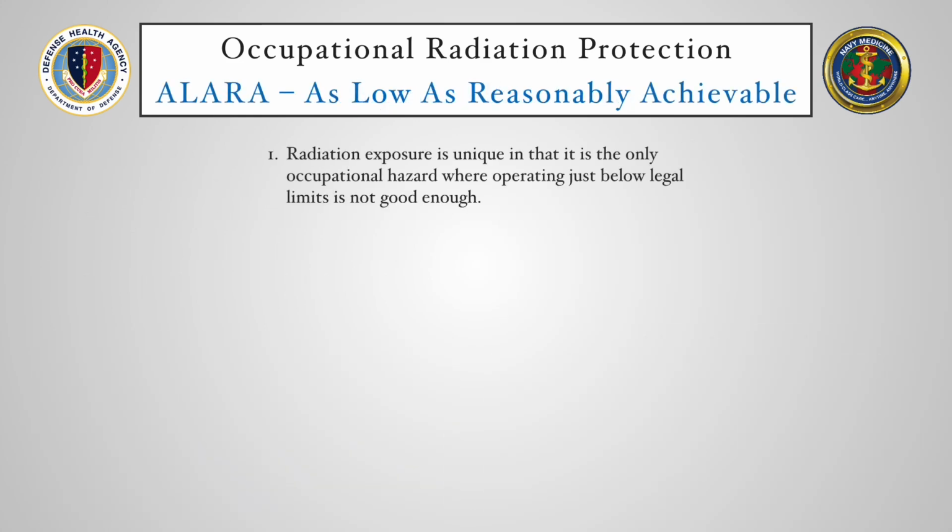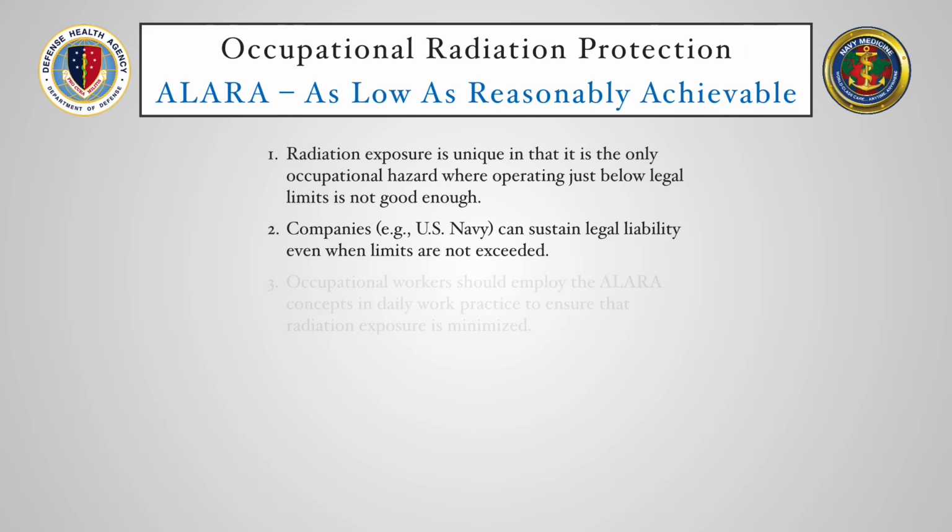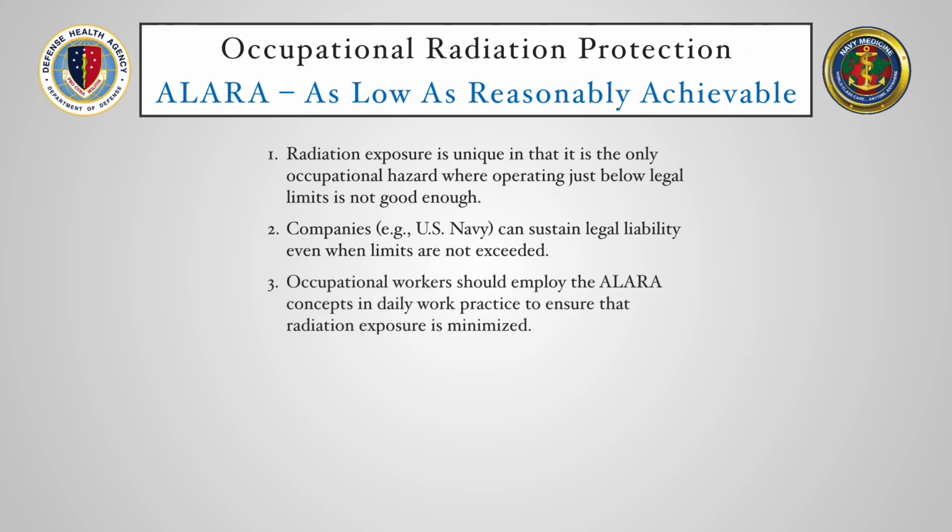Radiation exposure is unique in that it is the only occupational hazard where just operating barely below established limits is not good enough. Companies can still sustain legal liability even if limits aren't exceeded. All facilities and organizations are required to employ good practices and implement radiation safety programs to ensure that the as low as reasonably achievable, or ALARA, concept is obtained.